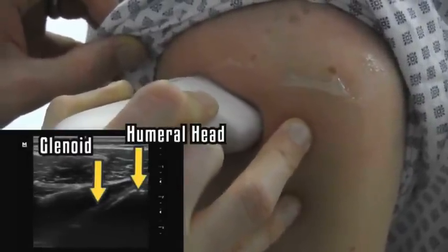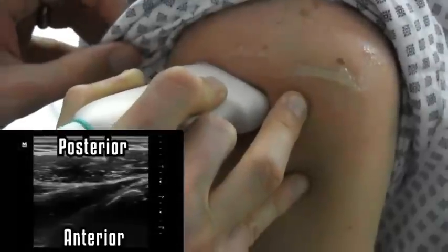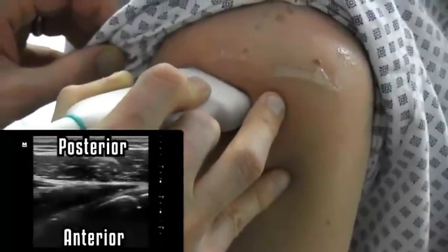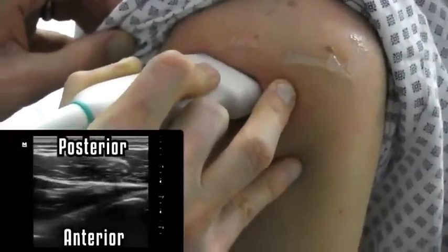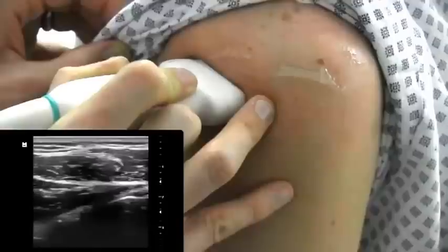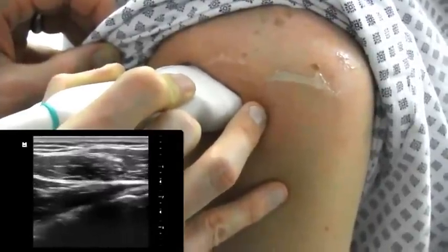You see here that the humeral head is slightly posterior to the glenoid, and this is normal. You can assess the other unaffected shoulder to see what is the normal distance for this patient.